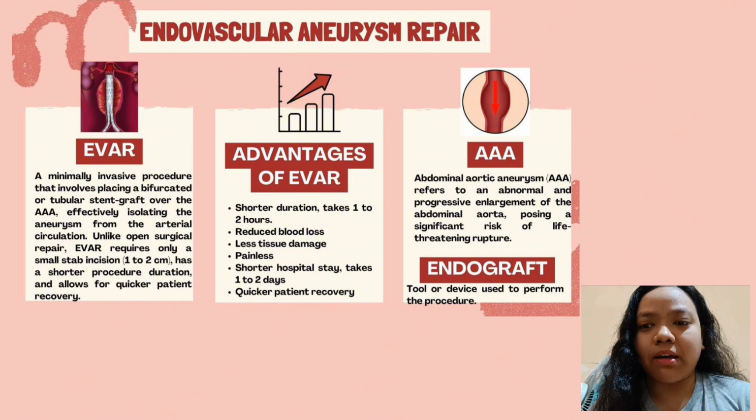Sa lalaki naman, 5.5 centimeter. Pag sa babae, 5 centimeter. So, pag around doon, the risk ng rupture is very high. So, kailangan mo nang mag-undergo ng EVAR kapag nag-reach ka ng 5.5 or 5 centimeters sa babae.